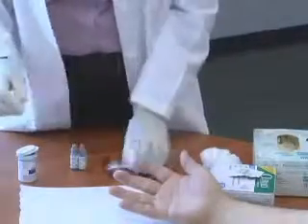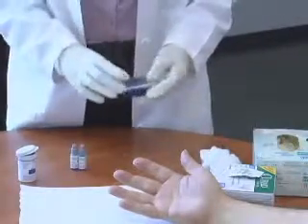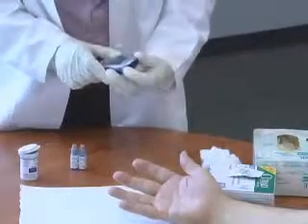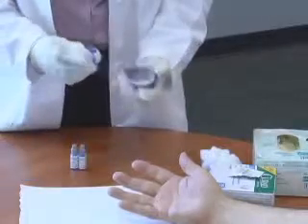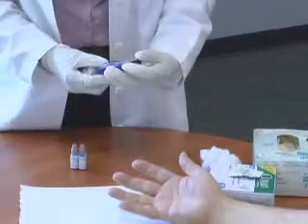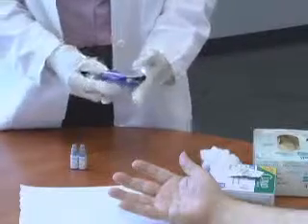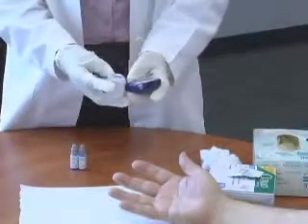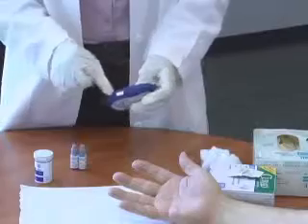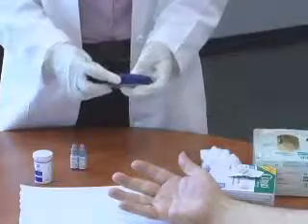Once we've allowed the finger to dry, the next thing we want to do is turn on the meter. We see that a test strip is popped up and it should show us a number — we want to make sure that the code on the meter is matching the strips. A code number should appear on the screen and you want to make sure it matches the code on the test strips. If it doesn't, for the AccuCheck Aviva, there is a little chip that should come with each bottle of test strips, and you need to replace that chip. For a OneTouch machine, there's a push button you would press to change that number.